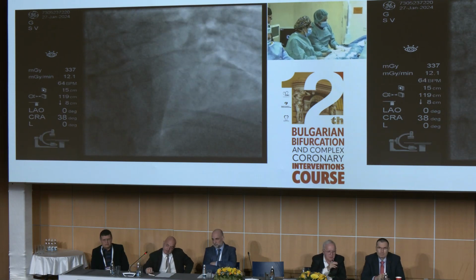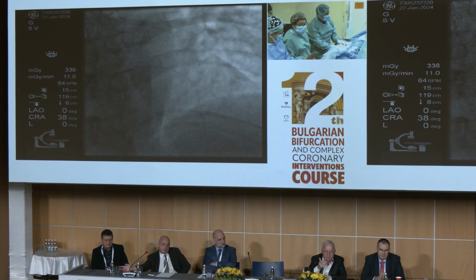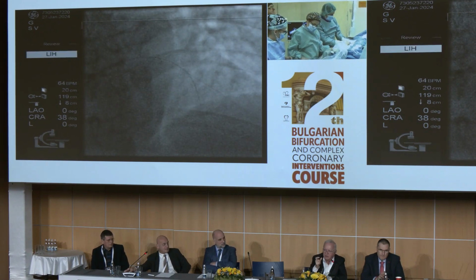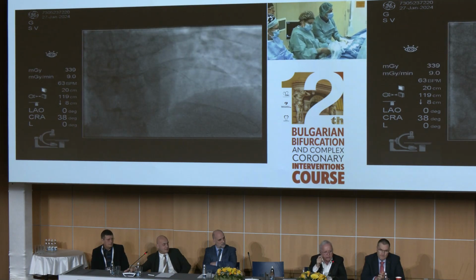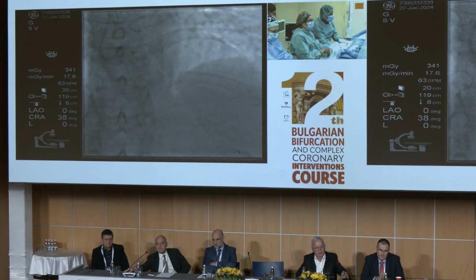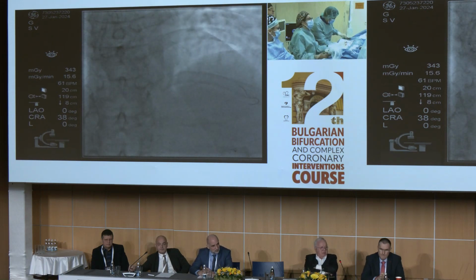So waiting for the IVUS, my strategy will be to choose a 3.0 stent. For the length, we can also measure, or use the radio opaque part of the guide wire, and with the POT we'll reach a diameter of 3.8. Here comes the sun. So I will give you another information later how to get this diameter. 3.8 proximally, 3.2 distally, normal segment.